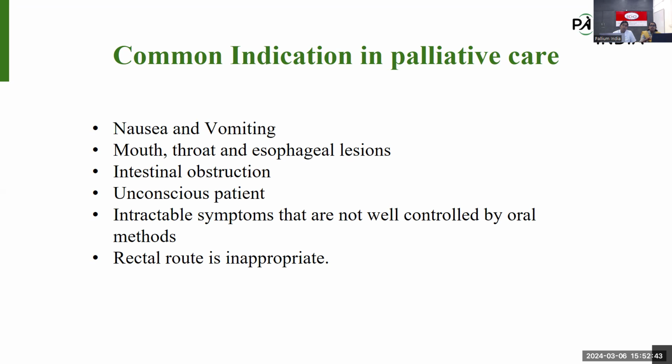When you introduce some fluid into the subcutaneous tissue, it moves from the lower concentration to the higher concentration, so it will take time. At the same time, the fluid is going into the subcutaneous space, so slight edema will be there, but you have to tell them that the edema is normal.